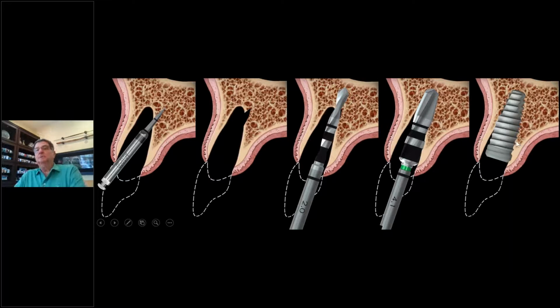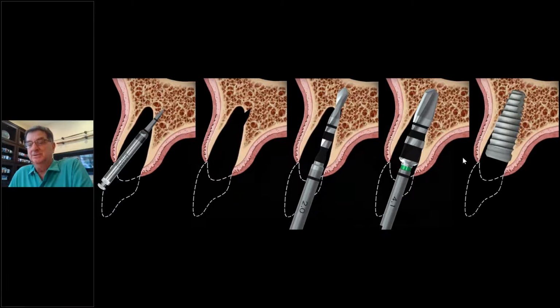Now, he mentioned, notice the implant here that we're using in most of these cases, as you see, platform shift, laser lock top. The platform shift laser lock by BioHorizons works beautifully. Now, where do we place it vertically? We place it about at the buccal crest if it's there, or 1 millimeter apical to it. And there's the other key, 1 millimeter apical. That's about 3 to 4 millimeters below the free gingival margin on the facial.